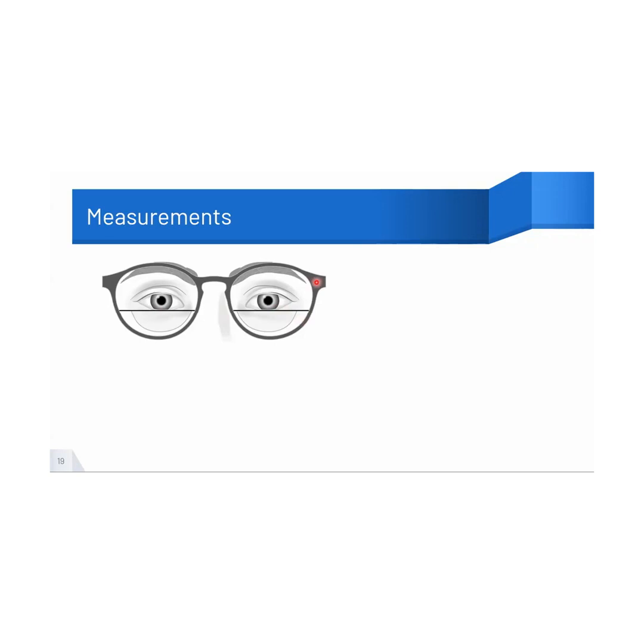Anybody on the chat box? I'll wait for 30 seconds. If your lower lid margin is loose and your entire cornea is exposed, what will be the mark that you will be taking for your bifocal segment? What will be the segment height? I just got one response.